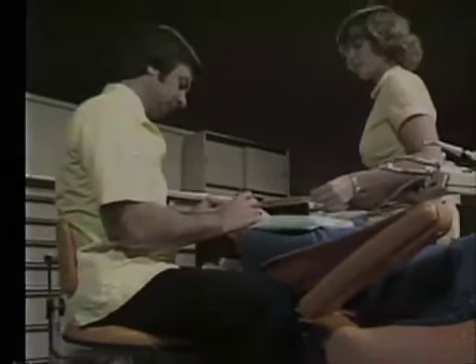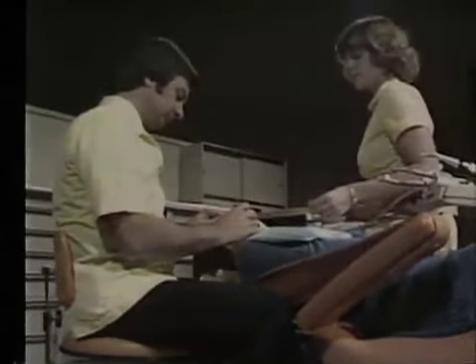Selection of a stable, well-cushioned operating stool is a prime factor in positioning the dentist. A back support is generally preferred for the operator since an abdominal support may interfere with access to the patient. A convenient hydraulic height adjustment is also helpful, especially if several dentists use the same operating stool. The operator is seated with feet flat on the floor. The seat is positioned low enough to allow the top of the thighs to be rather horizontal.